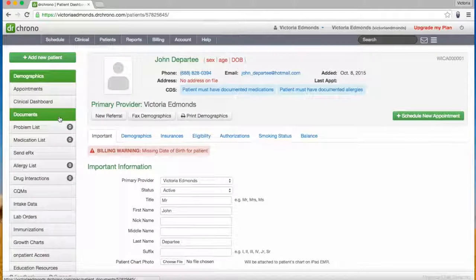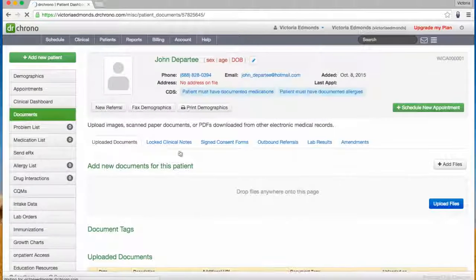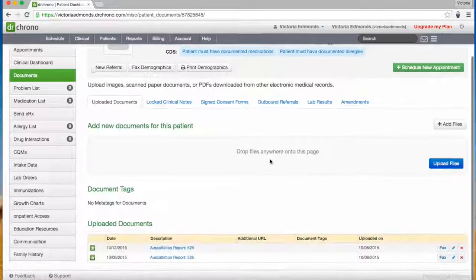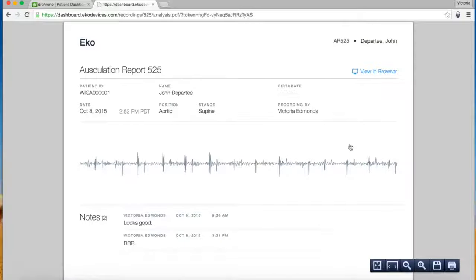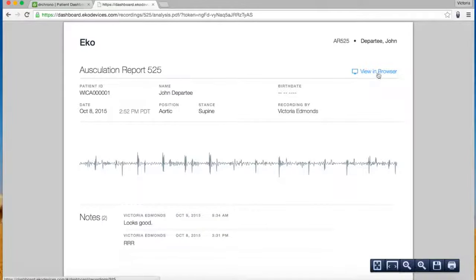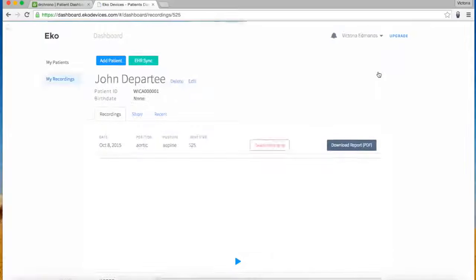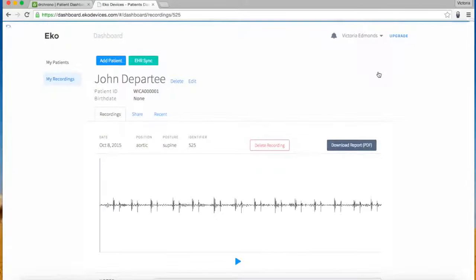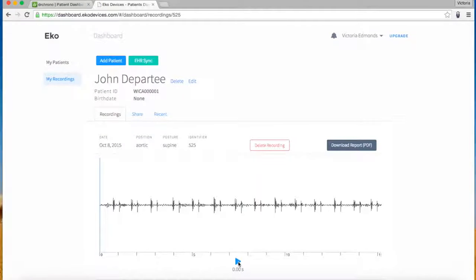You can now click on Documents to view the PDF auscultation report we just created. Click on View in Browser to be redirected to the recording on the Eko web dashboard. You can play back the recording and add notes.